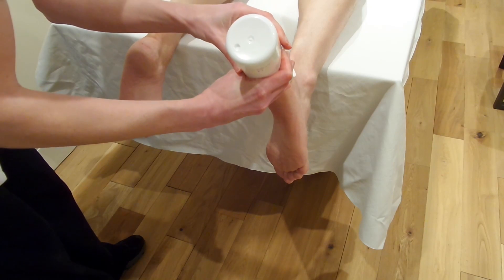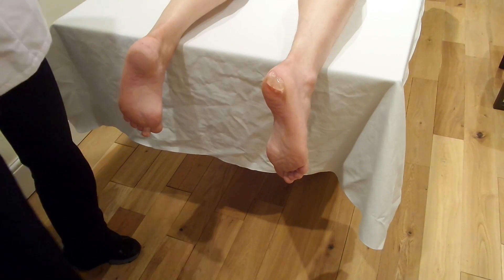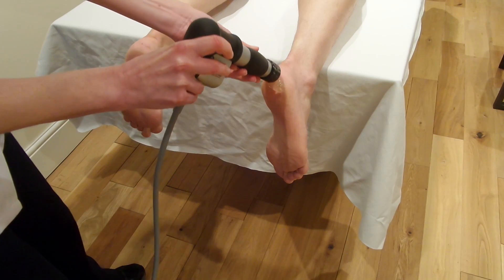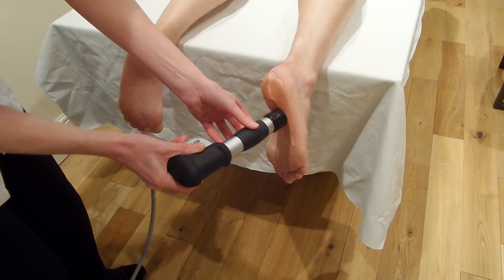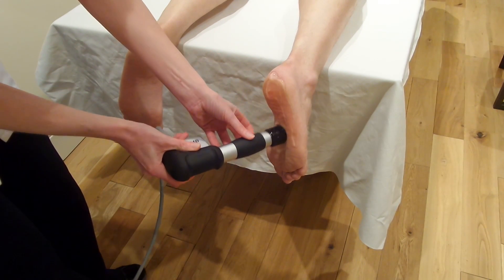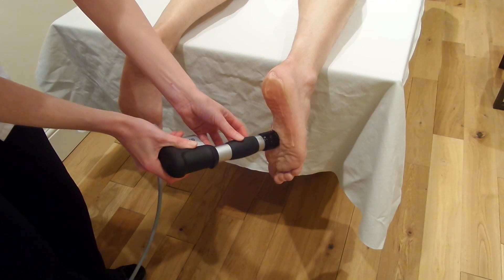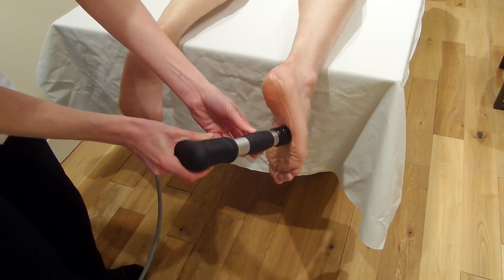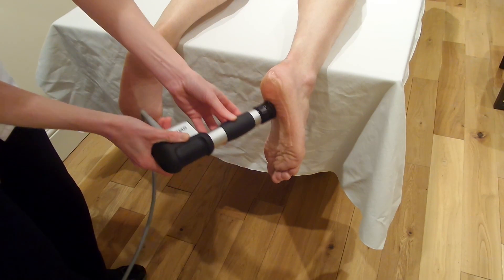Apply some gel here and apply the gel again on the heel just so it doesn't slide down the foot, and then we're going to spread the gel out across the foot, encompassing the whole of the plantar fascia. Then we'll start at the proximal end and work down.